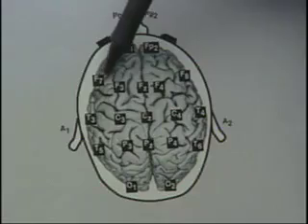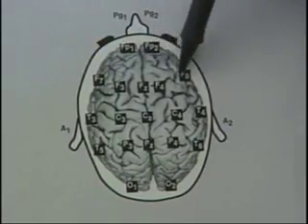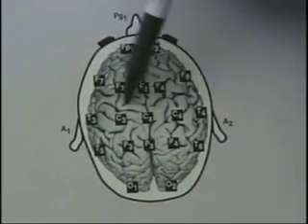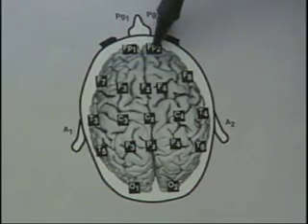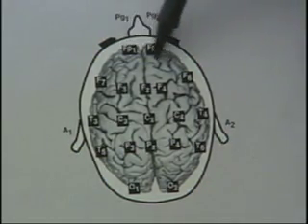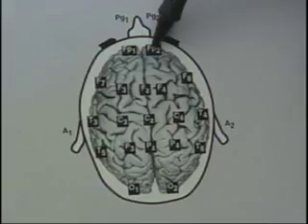The F locations, F7, F3, FZ, F4, and F8, lie over the frontal lobe. FP1 and FP2 are in the prefrontal areas. The connection is made directly on the forehead.